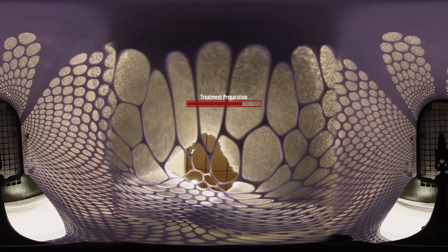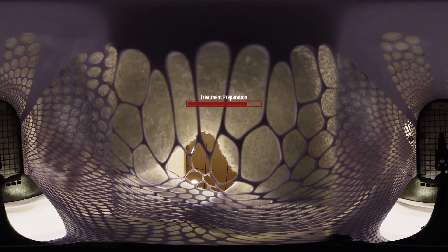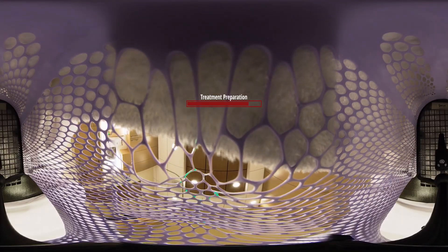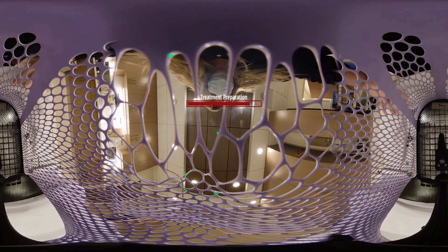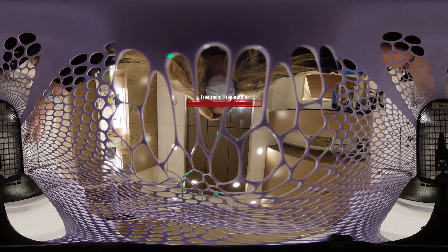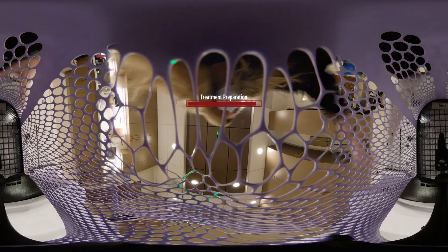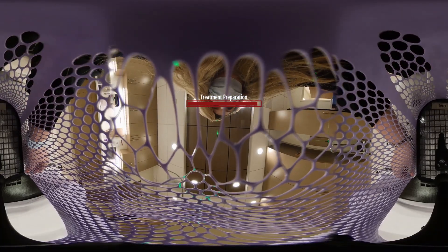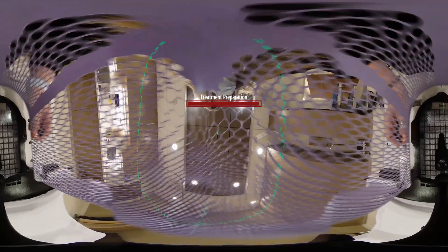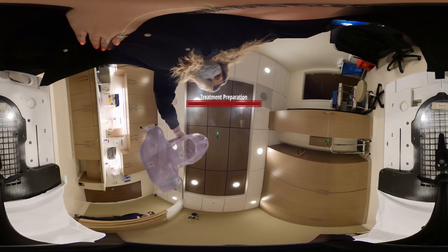Very good. Your mask is just about done. Let me just test the temperature. You feel like you are all ready to go. I am just going to take the mask off. I am going to unclip the mask. Go ahead and start wiggling your face. There you go. And that is it — that is your custom mask. That is what you will wear for every single treatment.